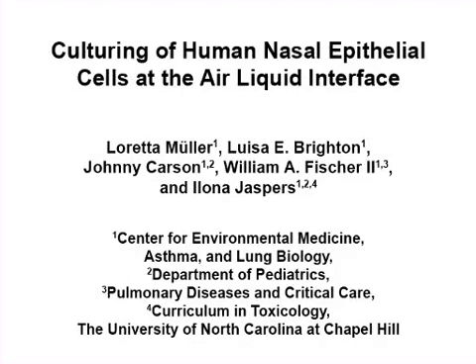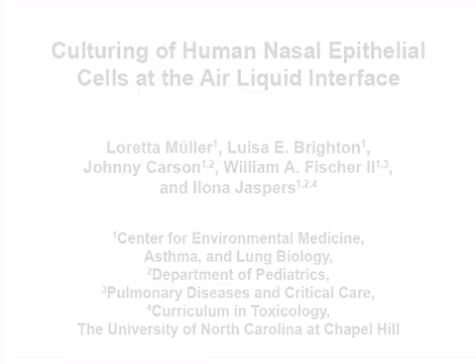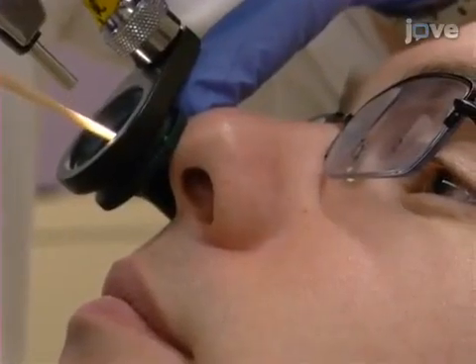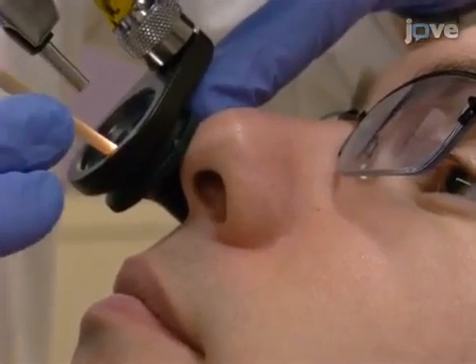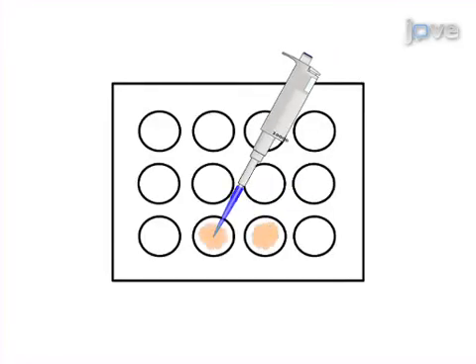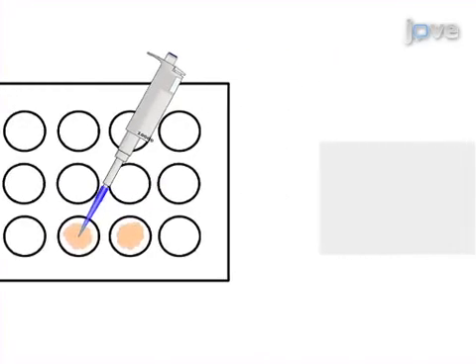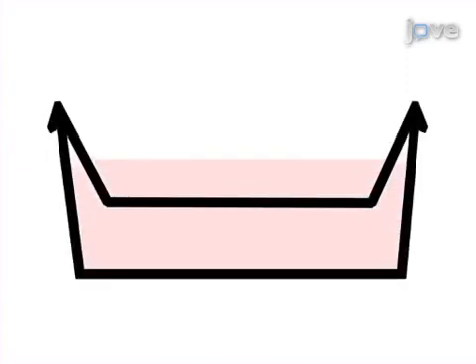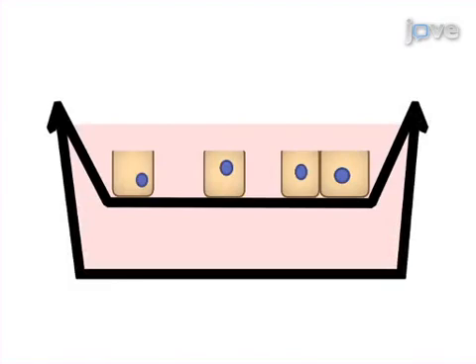The overall goal of this procedure is to culture redifferentiated nasal epithelial cells at the air-liquid interface. This is accomplished by first obtaining superficial nasal epithelial cells from a human volunteer. The second step is to seed the cells on tissue culture plates and then expand the cells in flasks. Next, the expanded cells are seeded into transwells and grown to confluency.